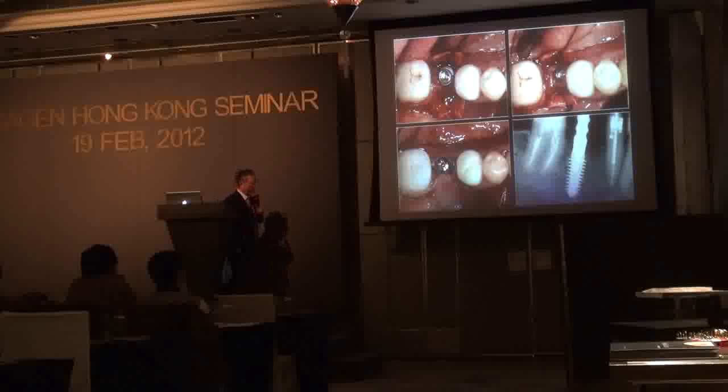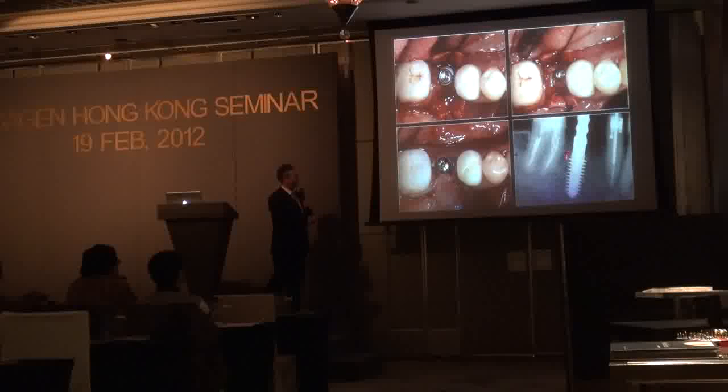And on the X-ray after 6 weeks, look at this. It's very nice tissue response. Right? If we place conventional 5 mm diameter implants, we'll make bone dehiscence defects here. You should do bone graft and membrane, and you should make primary closure and wait 6 months at least. So it's too much.